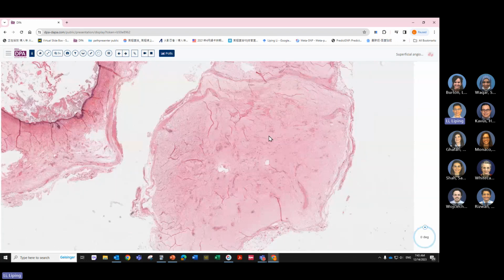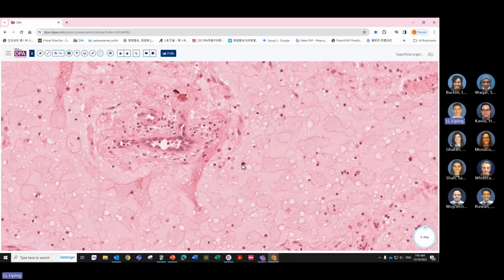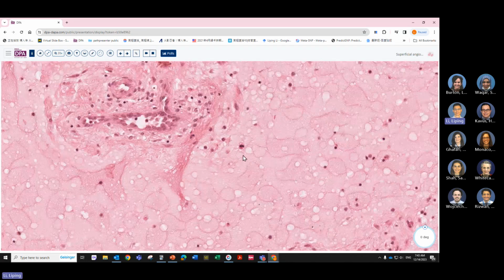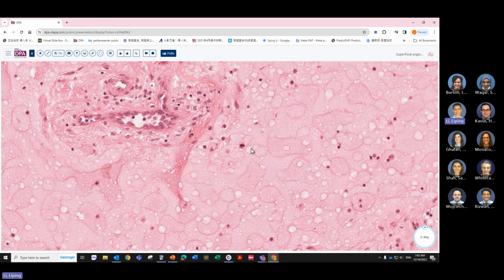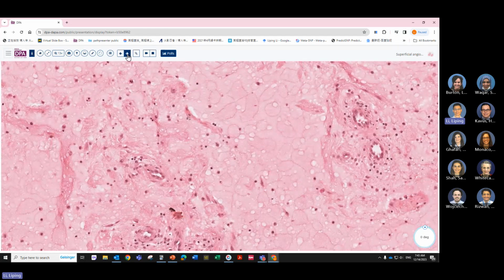And we zoom in to see this bland-looking spindle cell, and then again we see our neutrophil. So if you forget all of the stuff about this entity, remember this neutrophil, especially if you are not thinking about it. When you zoom in on this hypocellular entity, you find neutrophil. Oh, you're thinking maybe this is cutaneous myxoma.